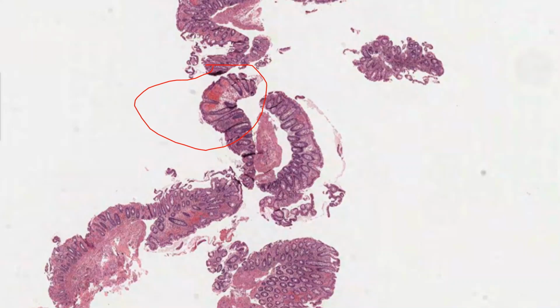So this area, for example, which I have just drawn on, is different. Another area here, which I wanted you to remember, I have just put a circle around. And then the surface as well looks different. If I look into this surface, the epithelium is intact and it looks okay.